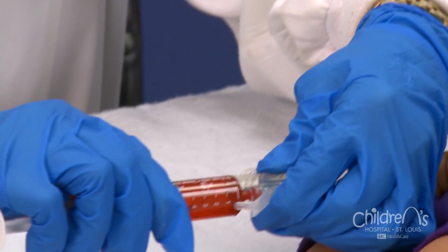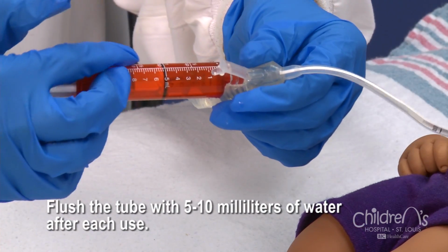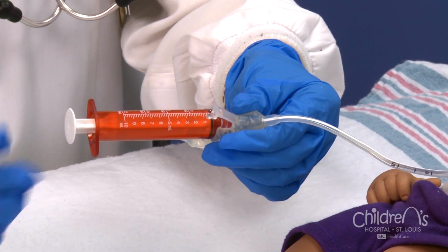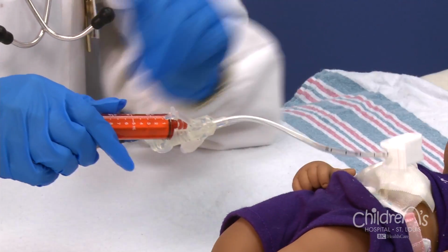Open the medication port and attach the syringe with 5 to 10 milliliters of water to flush the tubing. Unclamp the tube and push in the flush, and then clamp the tube again. Remove the syringe and close the med port.